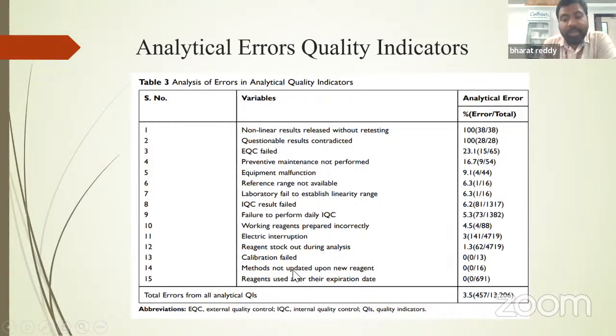Methods not updated upon new reagents. When we are installing new reagents, we have to upload new reagent methods. Reagents used after their expiration date. This is very important. After expiry, we don't use any reagents. These are all the analytical quality indicators.